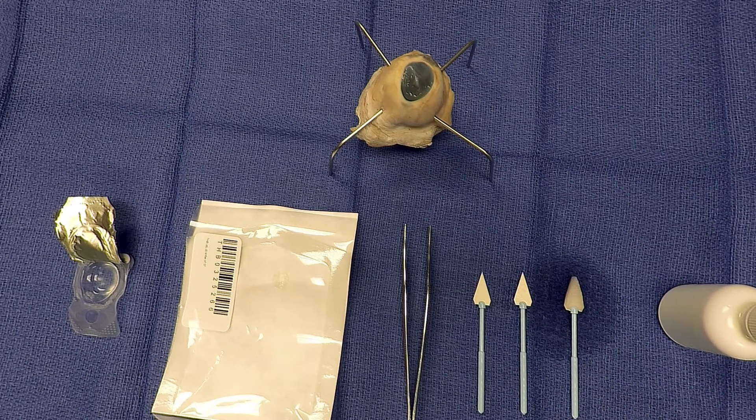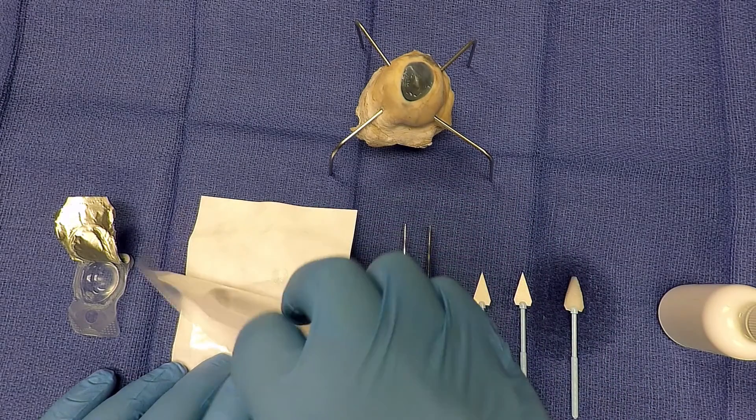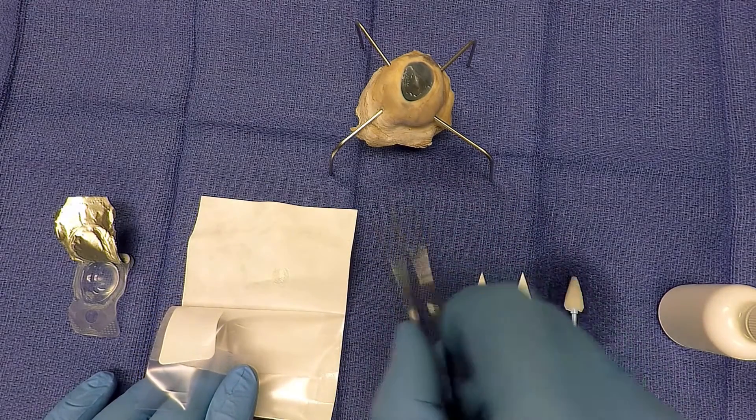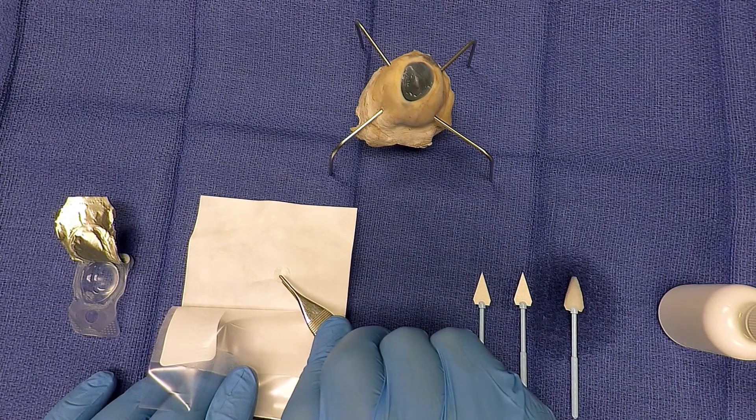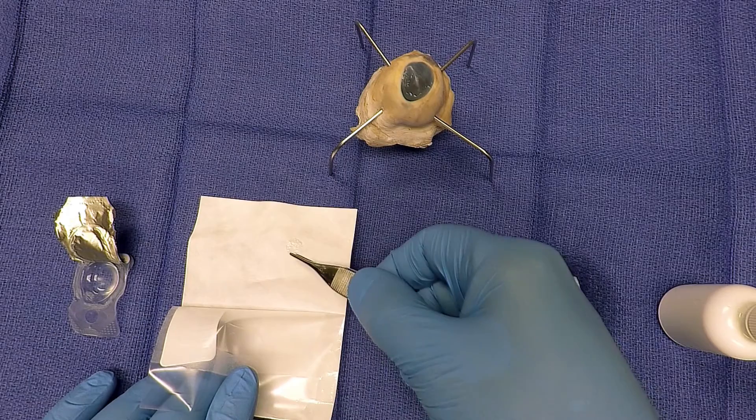Next, take the Eclipse Amniotic Membrane pouch and open it for the application process. Only open the pouch when you are ready to place the graft in the eye. Use the smooth tip forceps to grasp the membrane and place it on the surgical site being treated.